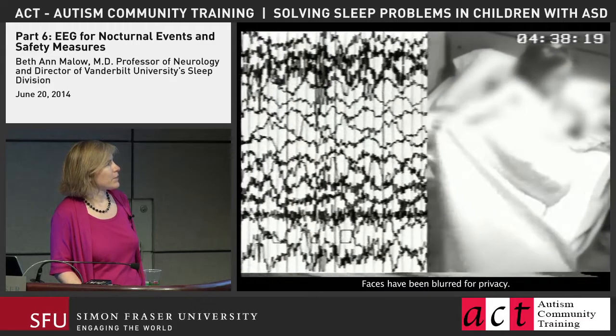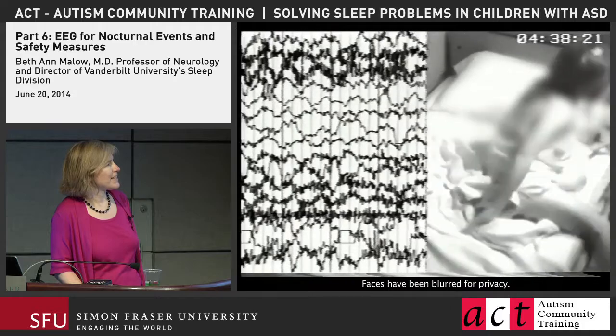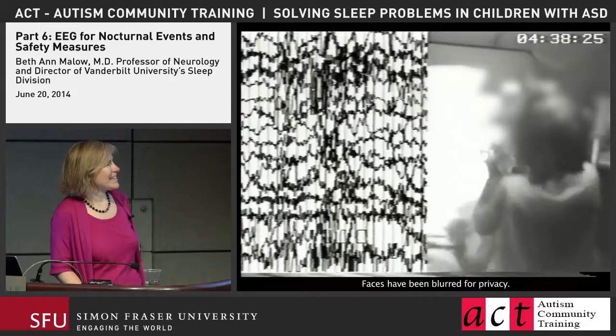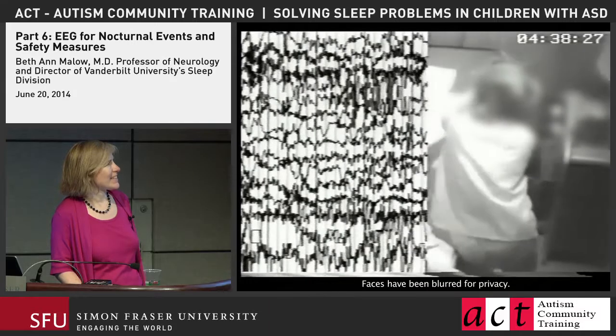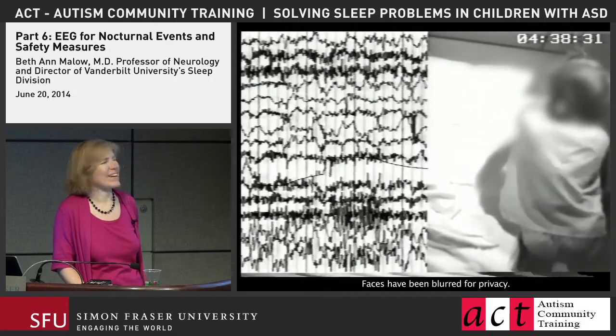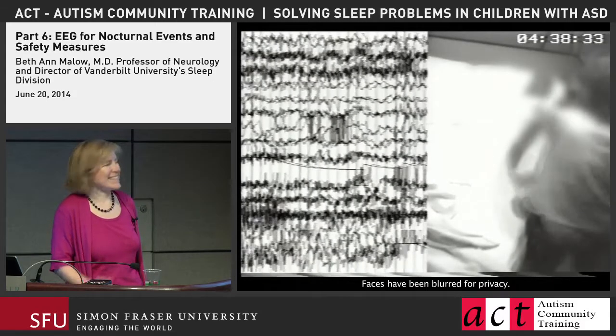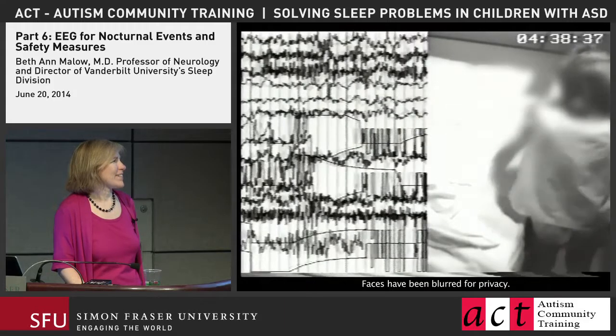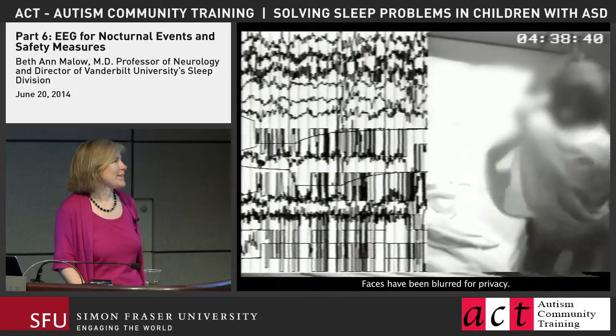And what you're going to watch her do in a moment is get out of bed. She finally makes it. And then she does something that the sleep techs I show this to find incredibly funny. She starts destroying the evidence. She starts unplugging the box that her wires are coming from. And she does it pretty vigorously.